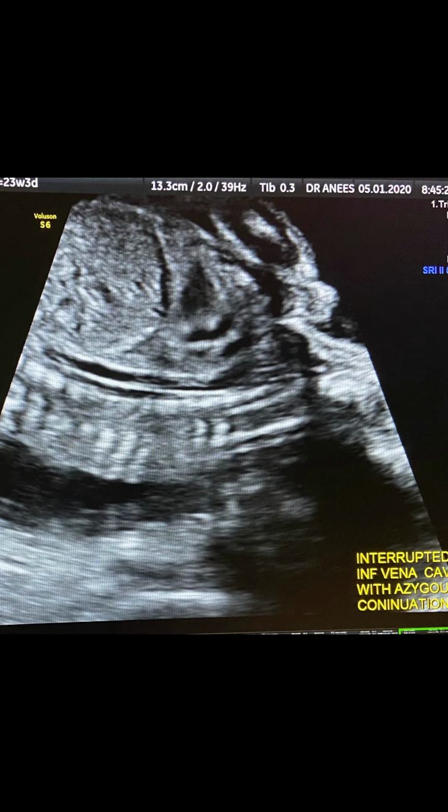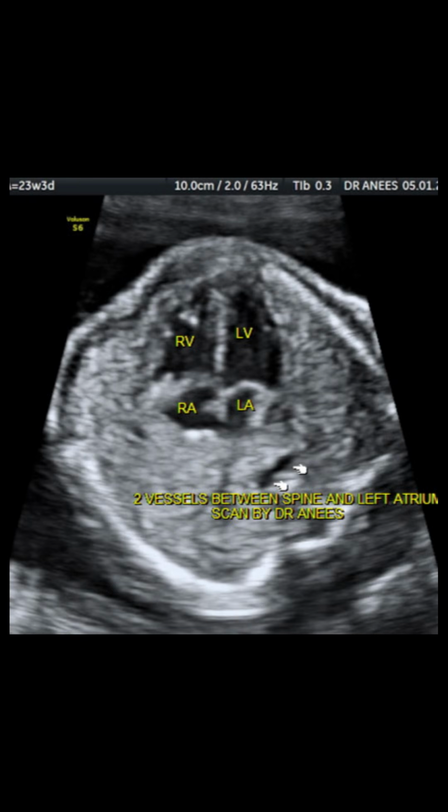For confirmation, we should examine the sagittal section. In this picture, we can observe 2 parallel vessels side by side in the abdomen. Picture 7 is also a scan from the same case.